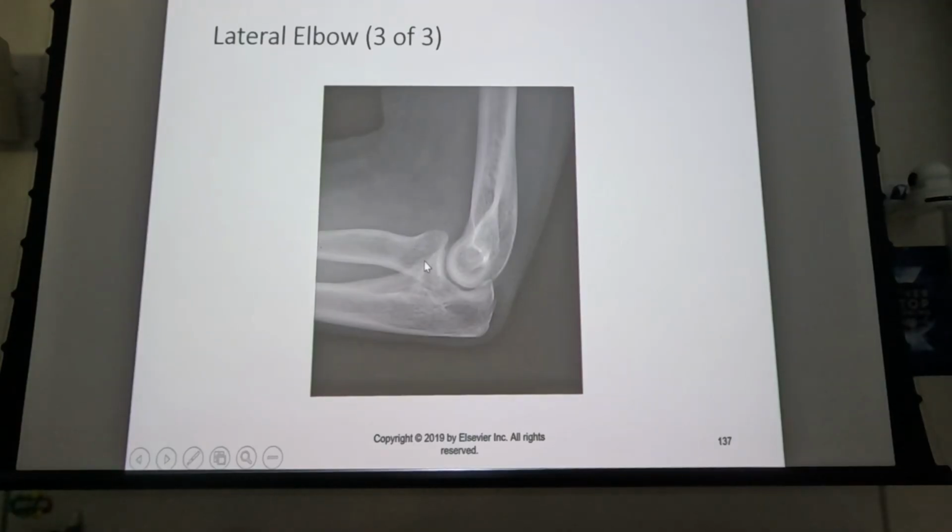Superimposition, right? So in these views, you're not going to see a lack of superimposition on the radial head at all. So what we might look for is that fat pad that should follow the contour here, and if it's bowed out away from the bone, that's a telltale indication the patient has a fracture we can't see, okay?